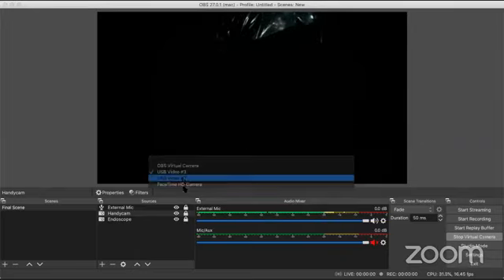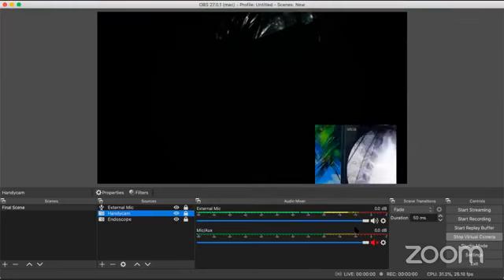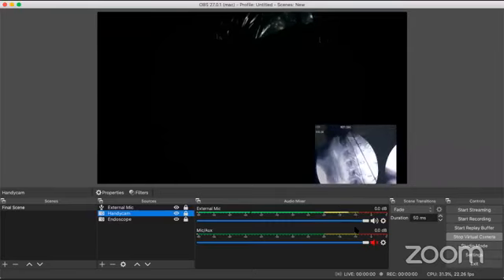Adjust the C-arm, please. Make it 90. Make it 90 to the patient. Okay. Shoot, please. Oh, little down, little up, little up. Shoot, please. Yeah. Now, if you can rotate it, sir, can you mirror it and please rotate it? Yeah, rotate it right now. Make it 90. Yes, yes, please. Thank you, thank you, thank you.